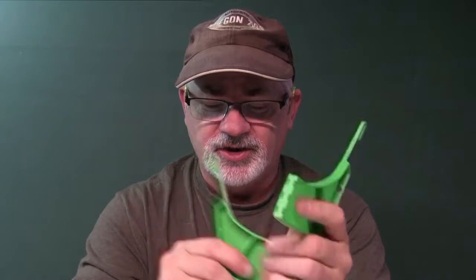The first part of our project is first we put together these two pieces. Now we have printed this face shield in two pieces because of the limited size of the print tray of the 3D printers that we have on hand. Had we had access to larger 3D printers, we could print this all as one piece. But being innovative the way we are, we have two pieces, and this first part is going to show you how to attach these two pieces using zip ties.